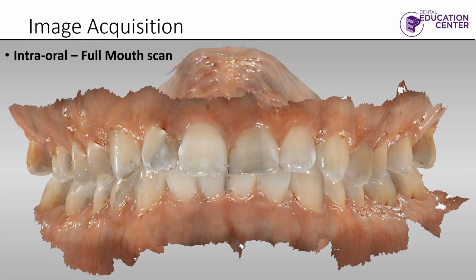Sure. Absolutely. And in your meet and greet or your hygiene appointment, they can take that scan. And a lot of times, there's a cavity and the patient's like, well, it doesn't hurt. I'm going to put it off. I don't have time. I don't have money. A lot of times what you can also do is, they'll call back a week later in pain, obviously, and you knew that was going to happen. But because you have that record already digitally, you can actually prepare the temporary, for example, of the compromised tooth even before they come back. I have that ready before they actually sit chairside, which is a lot of fun with some of this technology.